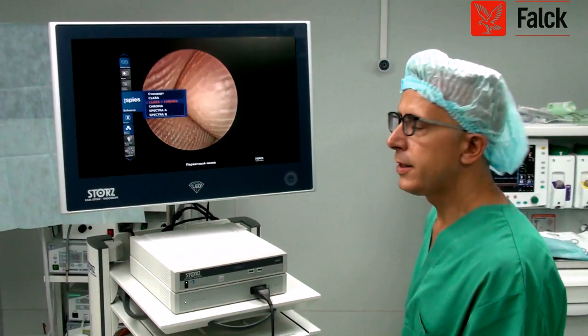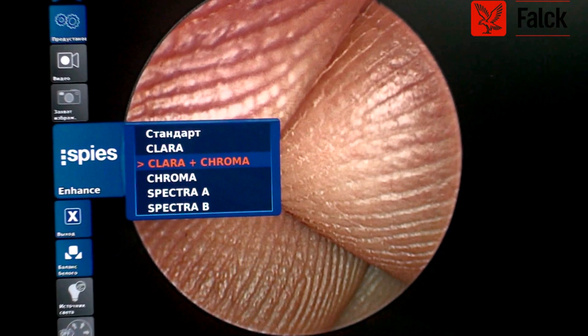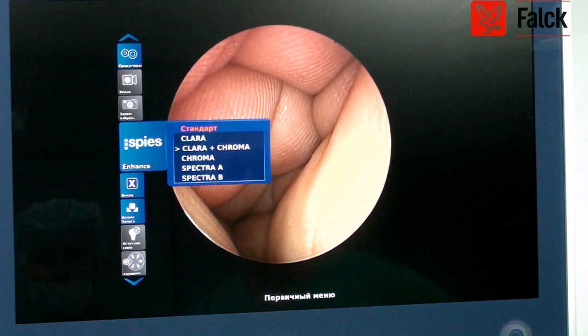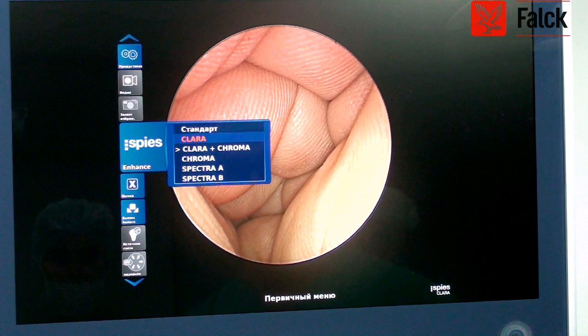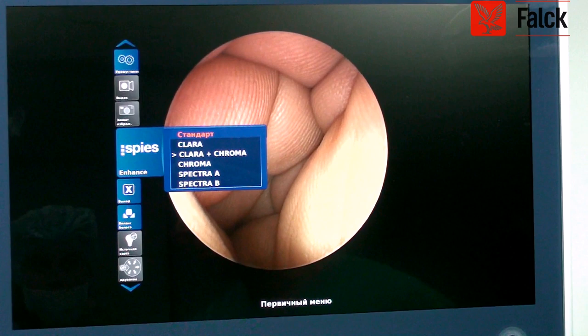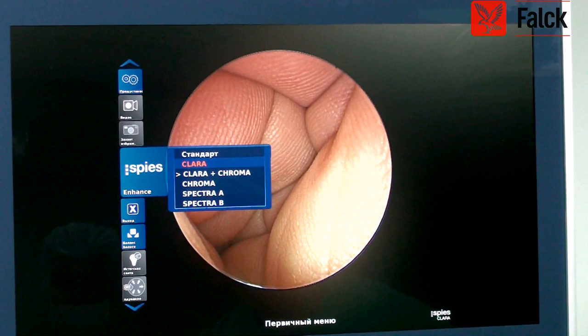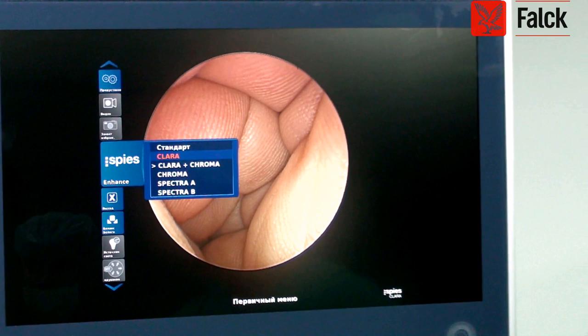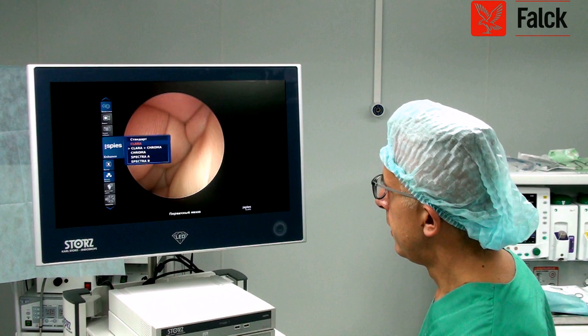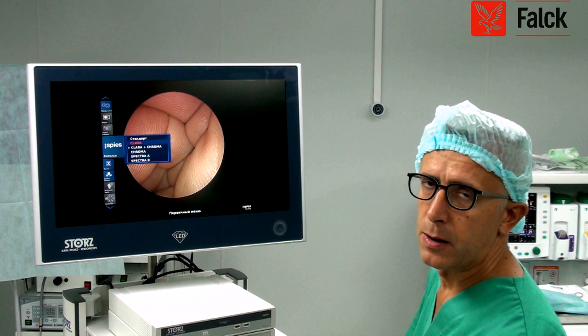That's the Clara plus Chroma. You'll see the change in quality of the images. So that's the standard. Then you can change to Clara, and you'll see that the more distant part will be illuminated — you can see deeper. Just by switching one button, you increase your vision. This is extremely useful in the nose, but I mainly use it in my department for the larynx and oral cavity. Clara is one option, and then you have Clara plus Chroma, where the red is a little bit more enhanced.